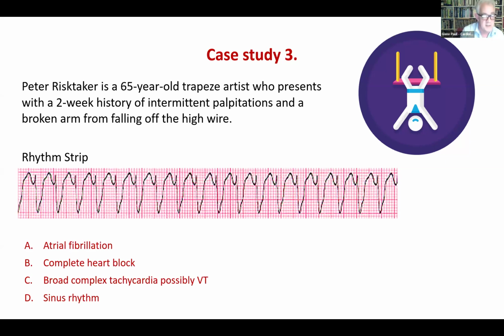So I would always go back to your basics, and barring that, get another ECG machine. But sometimes there is the occasional person, but normally from my experience, it's something I'm trying to take a shortcut with. And then I think, can't take a shortcut.